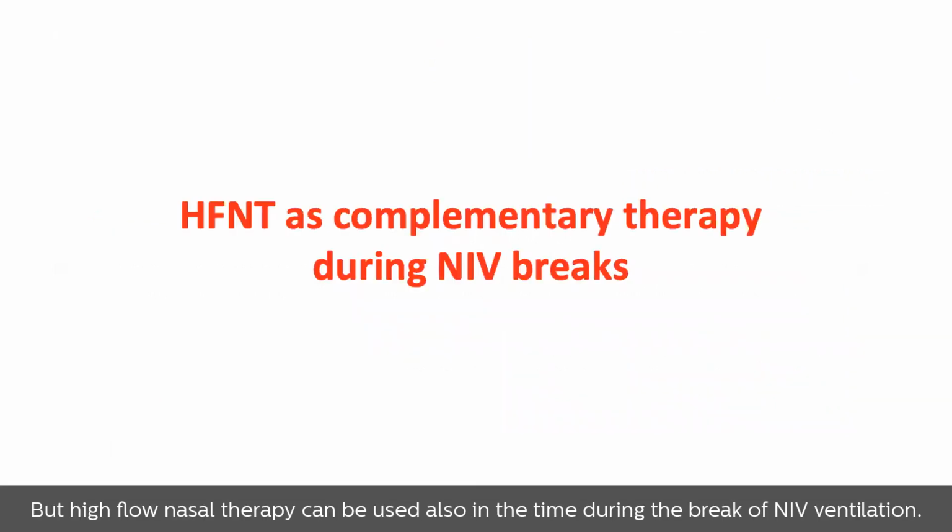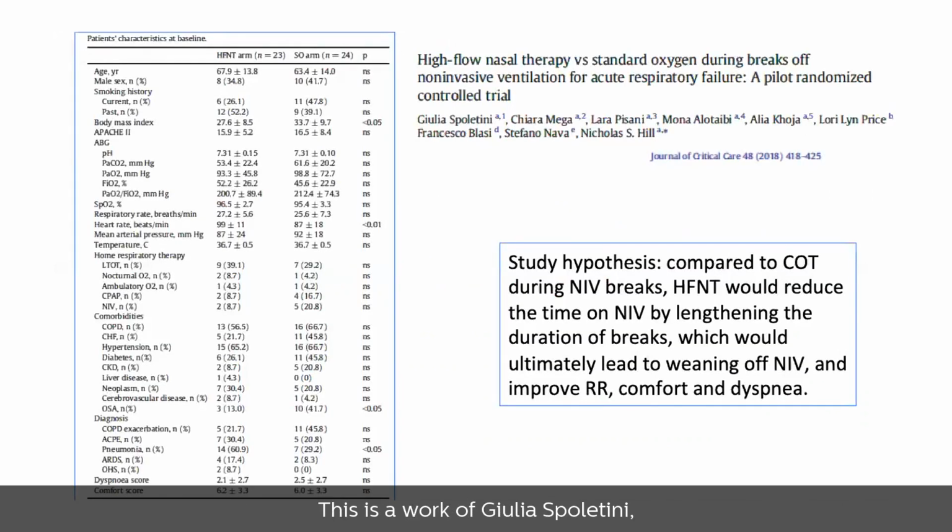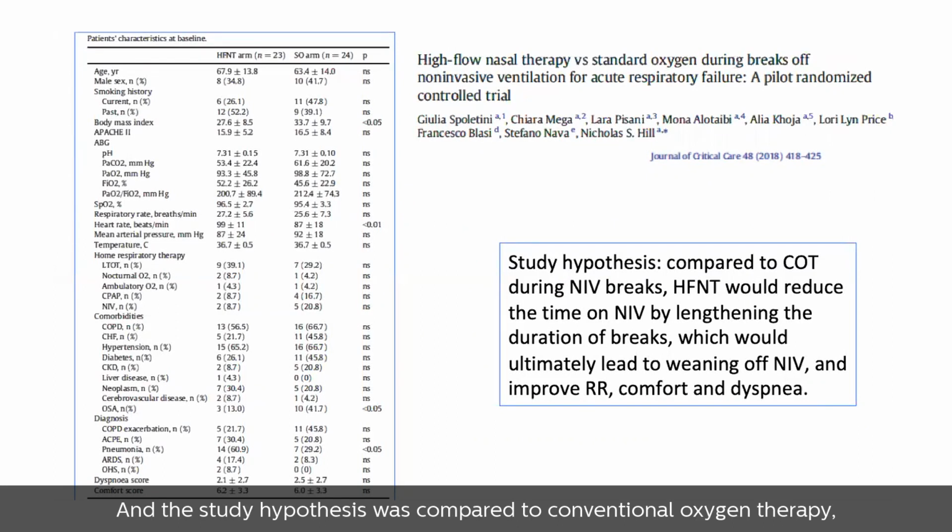But high flow nasal therapy can also be used during the breaks of NIV ventilation. This is a work of Giulia Spoletini. It is well known. It was published in the Journal of Critical Care in 2018. The study hypothesis was whether, compared to conventional oxygen therapy during NIV breaks, high flow would reduce the time on NIV.